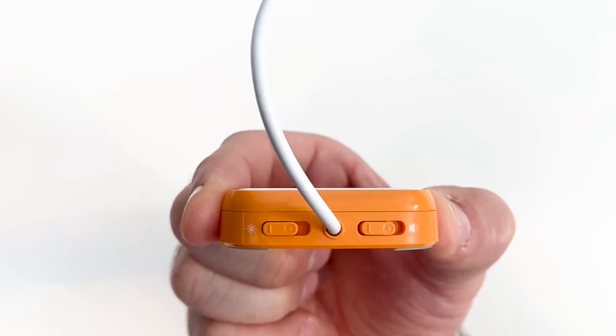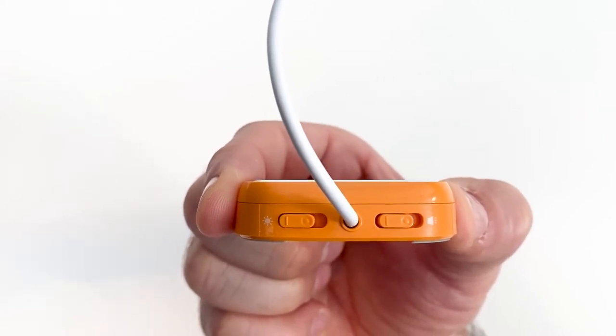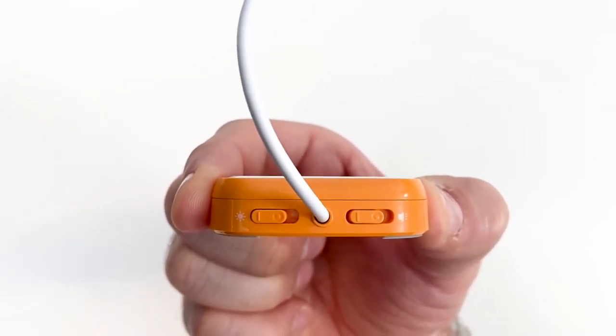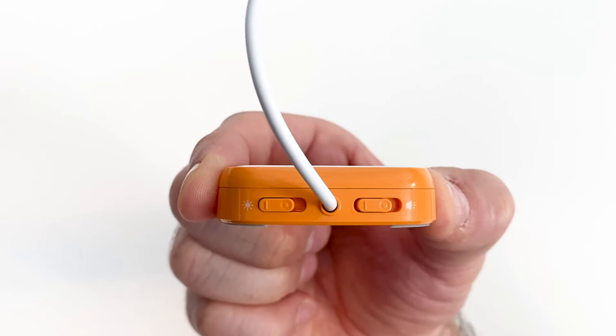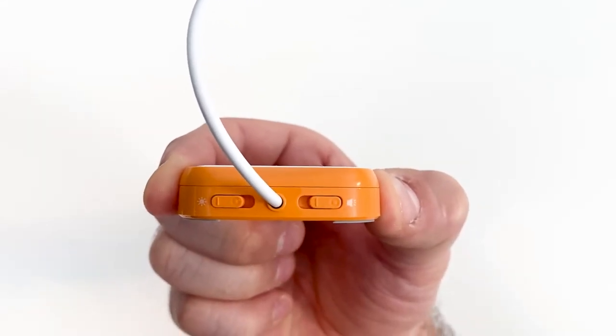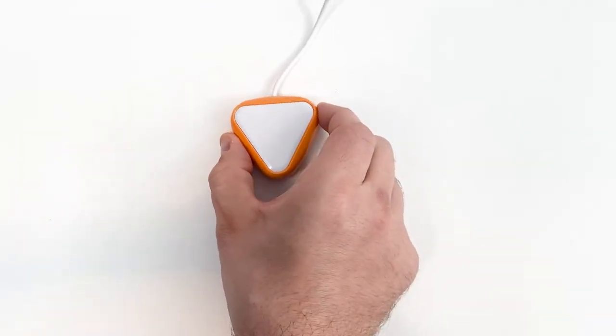The toggle switch for auditory feedback has a speaker icon located next to it. Move the toggle switch to turn auditory feedback on or off.